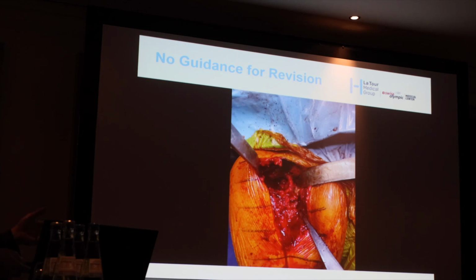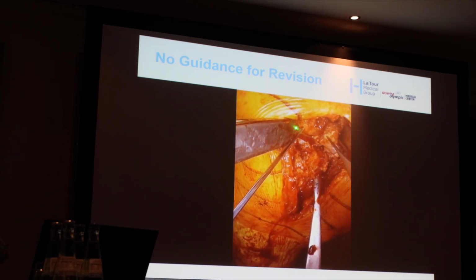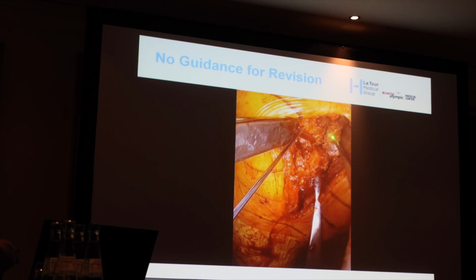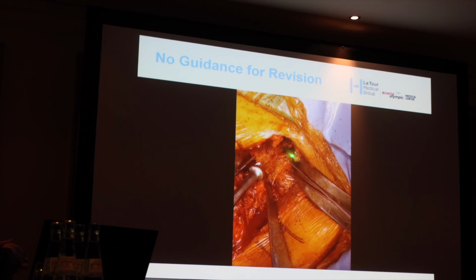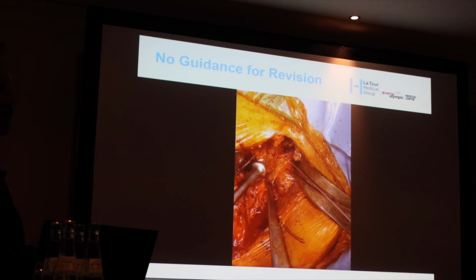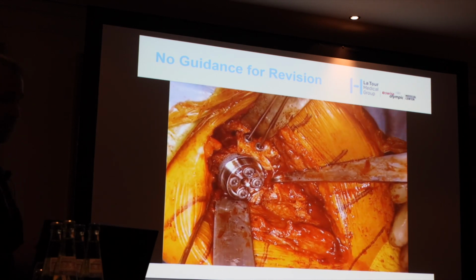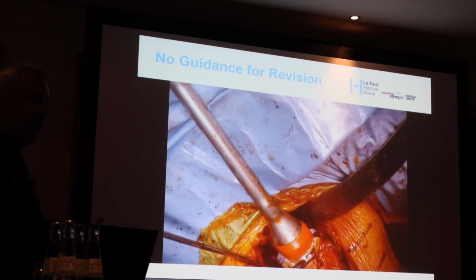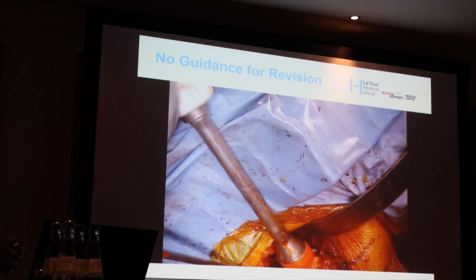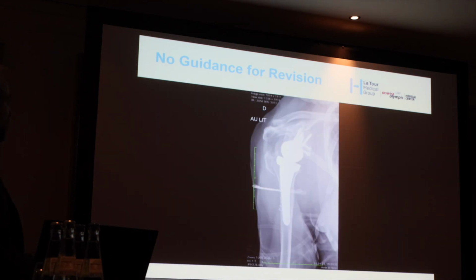Where do you put your pin? It's a revision prosthesis. You don't know where you should put your pin. You have no idea. So I grafted all the iliac crest posteriorly and then fixed the coracoid process anteriorly. And you just pray to God, put your pin, drill, and hope that you will obtain some kind of stability. And I had 2 very good screws, so I decided to go on and not to do a 2-step surgery. But I think that we are not really prepared.